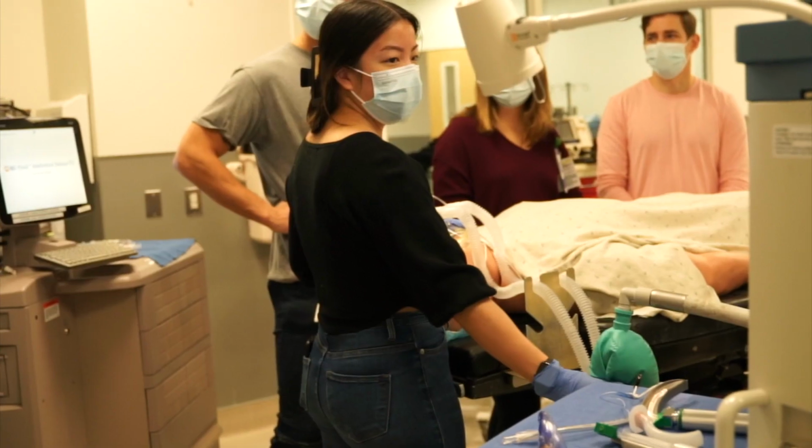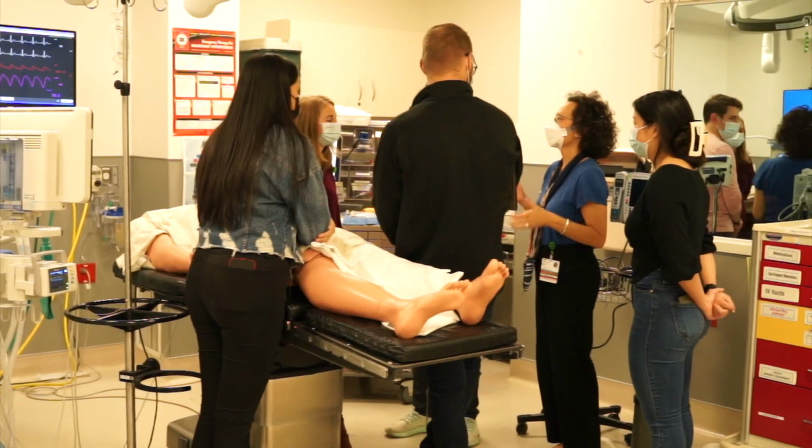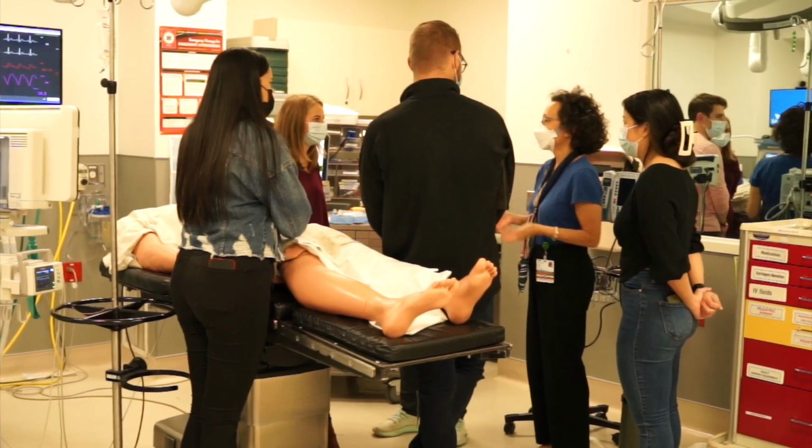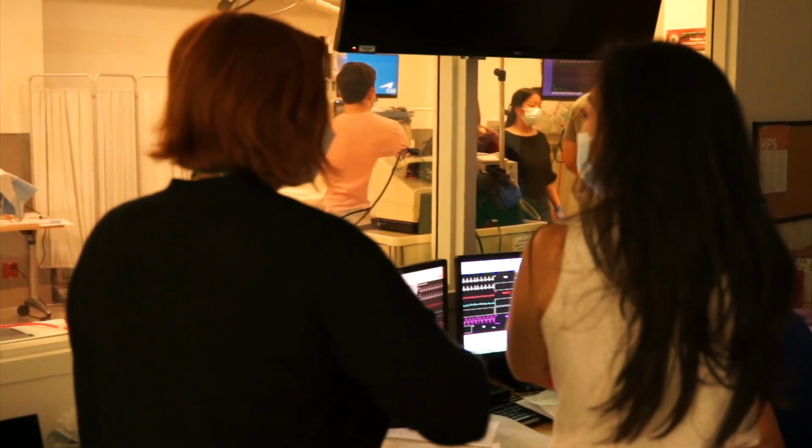So we practice induction, which includes giving medications, and then intubation, and then also maintenance of the patient throughout the anesthetic case, and then basically titrating for hemodynamics. In this simulation in particular, it's nice because we've given students the autonomy to create their own anesthetic care plan as well as execute it and see the anesthetic implications based on the management they chose.